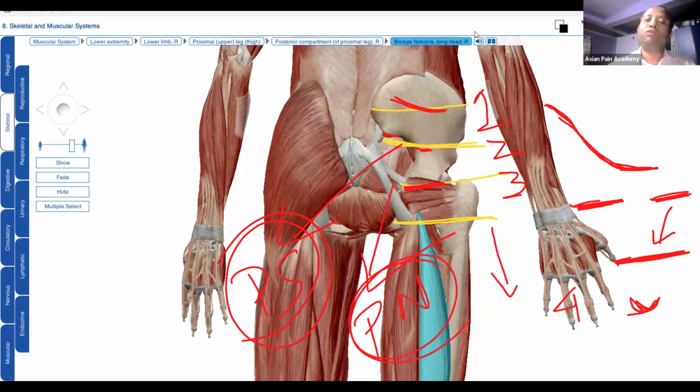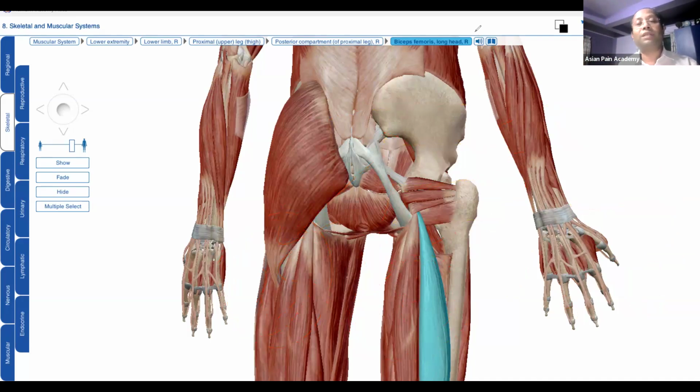Why do you need number 4 position? You need to see whether there is an ischiogluteal bursitis or a tendinitis of the hamstring muscles, the conjoint tendon, or the biceps femoris tendon. These tendons can have tendinitis or ischiogluteal bursitis. Number 1 position is not for a disease actually. This is for location purpose. We start from there. It is a home page area. So this is the posterior side.